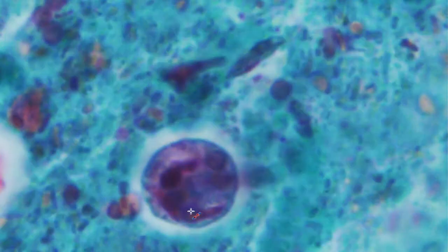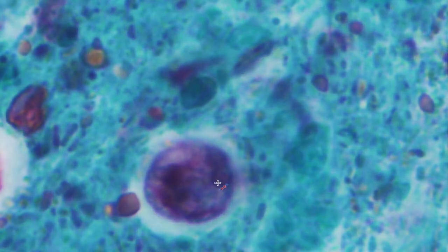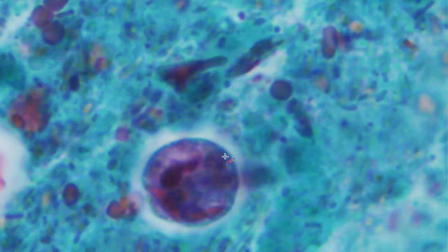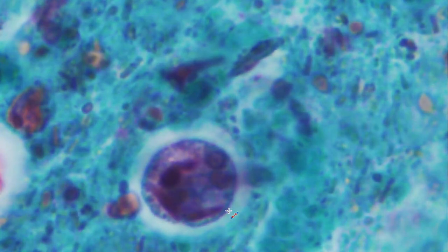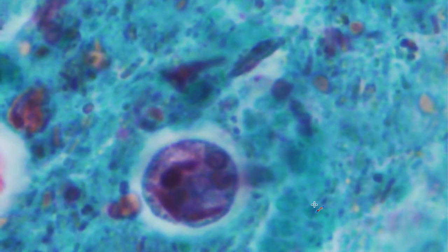And here we have a cyst. Now here's the nucleus. Bit difficult to see the full nuclear morphology, but you can hopefully see that there's 1, 2, 3, 4 nuclei. Lovely even peripheral chromatin, and most of them have central karyosomes. However, this one here has an eccentric karyosome, and that's not completely unusual. You will occasionally come across coli which have a central karyosome and histolytica with an eccentric karyosome. They don't always read the books, so just be careful of that. Here's some nice chromatoid bars. Let's find another one in here.